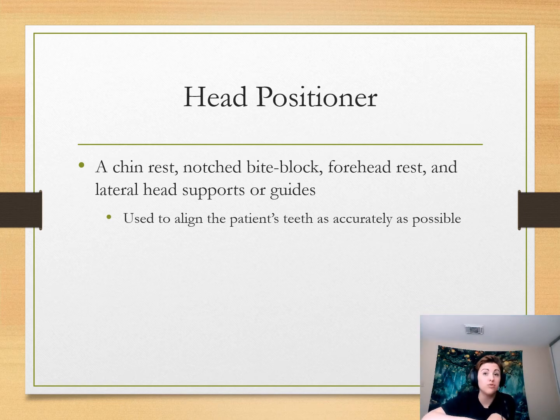You see it on page 248. You'll also see the patient in there for your figure 22-8. You can see how she's biting on that little stick. Sometimes it has a little place for them to rest their chin and then they bite on a stick. This one shows us one where she just bites onto the stick.